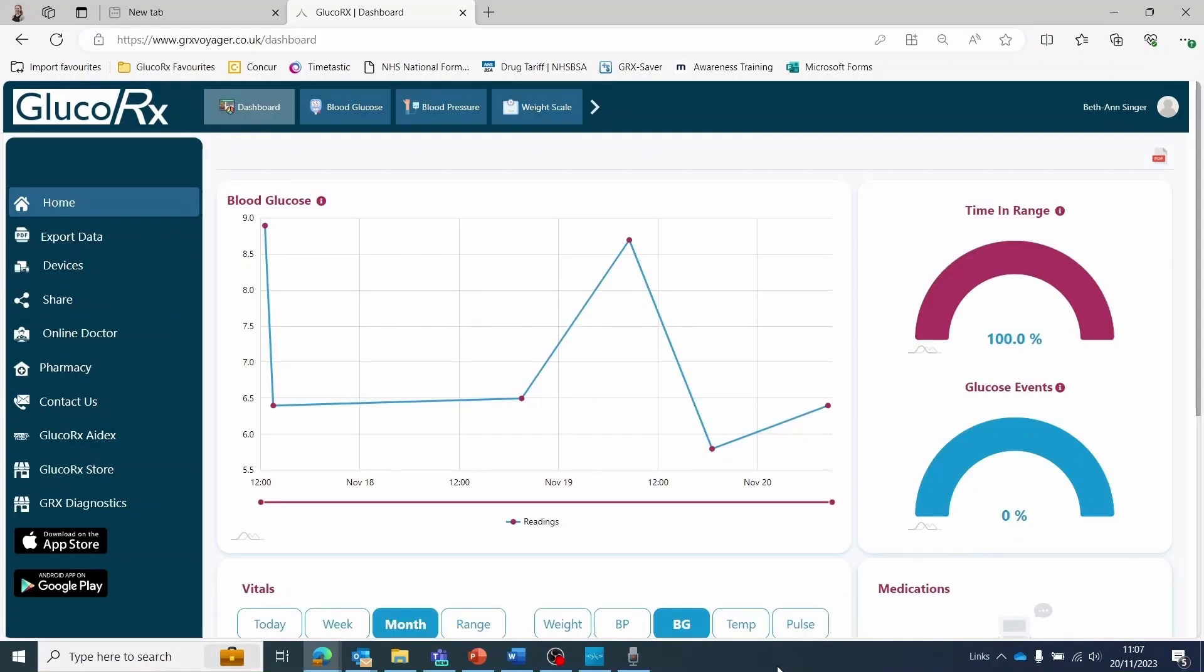The GlucoRx Voyager software will open into your main homepage shown as the dashboard in the top toolbar. This shows your recent blood glucose readings graph, your time in range, and any glucose events such as hypos or hypers.